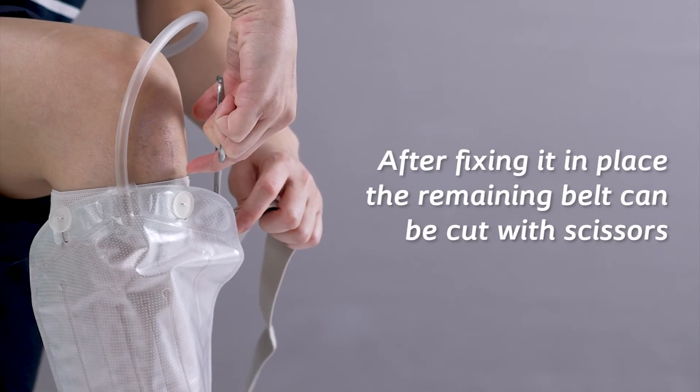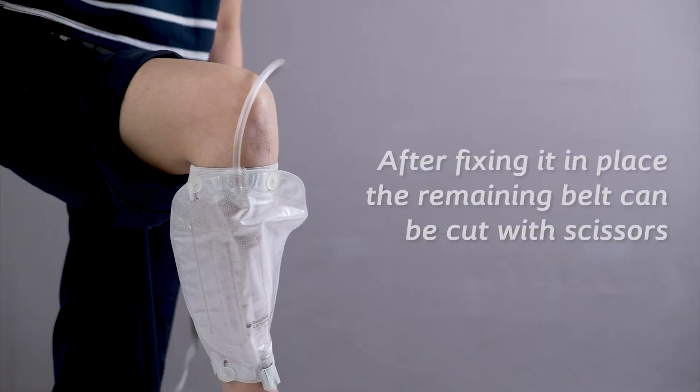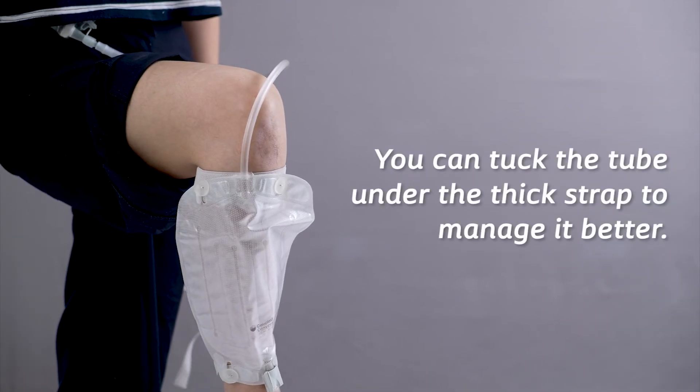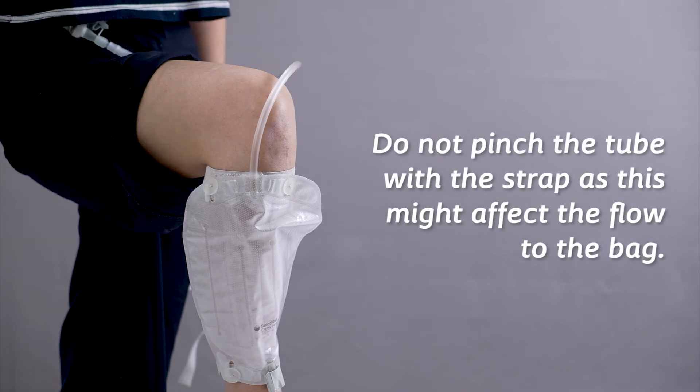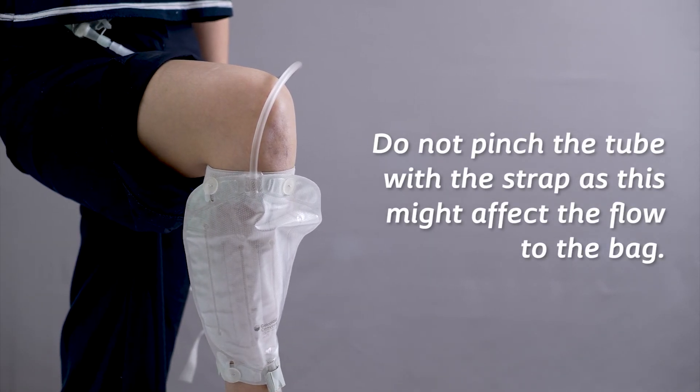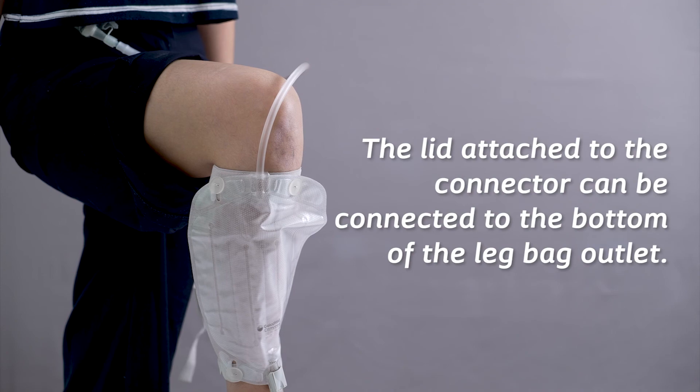After fixing it in place, the remaining belt can be cut with scissors. You can tuck the tube under the thick strap to manage it better. Do not pinch the tube with the strap as this might affect the flow to the bag. The lid attached to the connector can be connected to the bottom of the leg bag outlet.